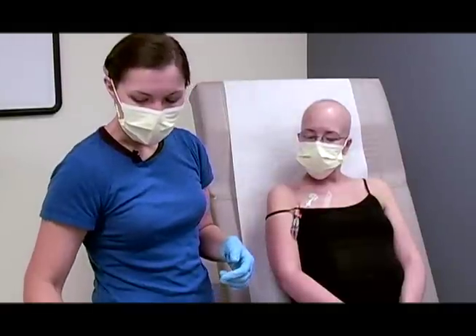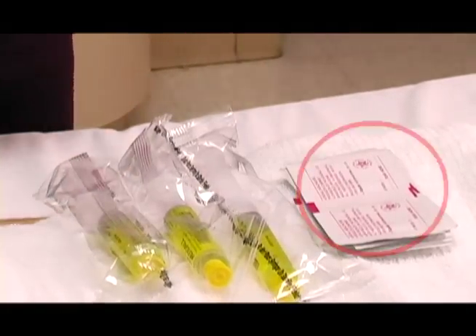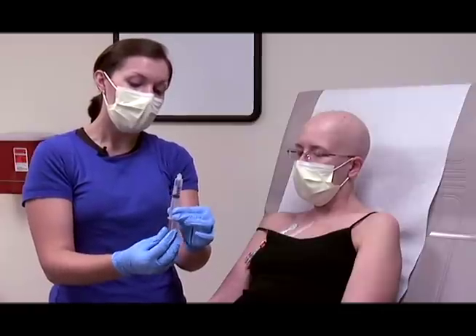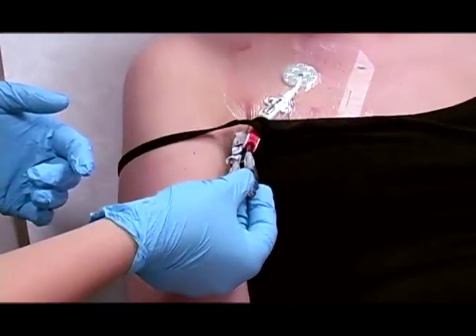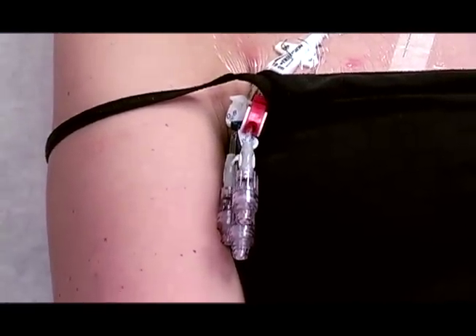Place all of the items you will need on your workstation. You will need an alcohol wipe and syringe for each line you are flushing. The syringes will be pre-filled with the solution, heparin or saline, ordered by your healthcare provider. If you are flushing 3 lines, you will need 3 pre-filled syringes and at least 3 alcohol wipes.